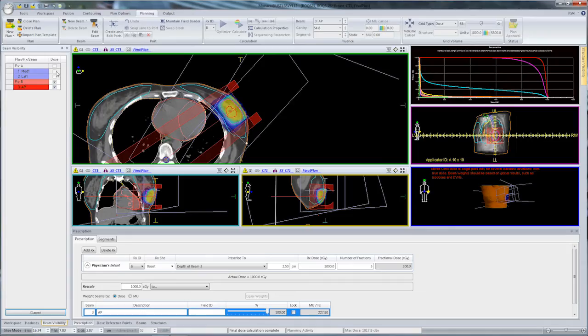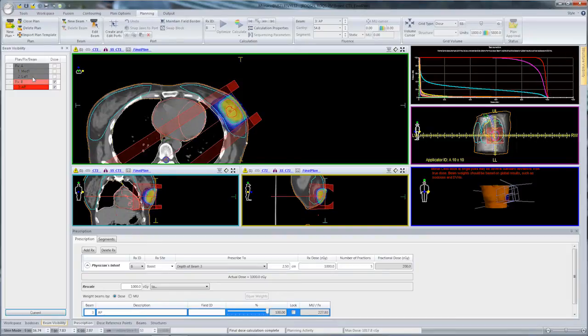Using the Beam Visibility option, I've turned the dose off for the tangents. I can turn the display of those beams off as well, because at this point I really just want to look at RxB, which is the electron boost.